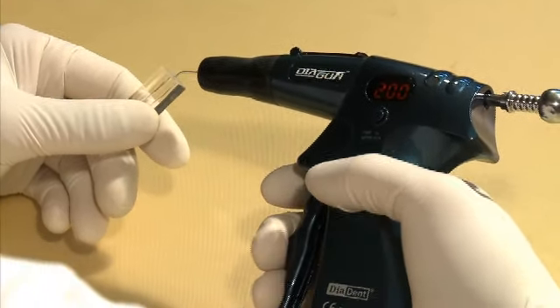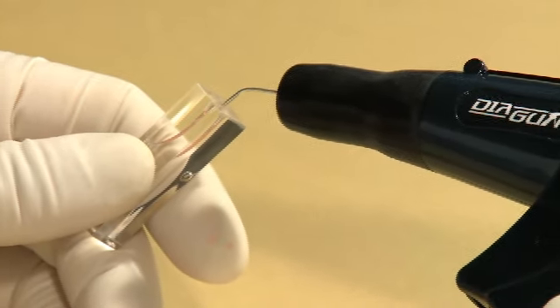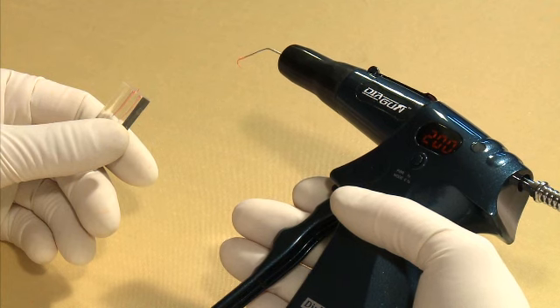Once the selected temperature is reached, insert the gun tip into the root canal and begin squeezing the trigger to fill the canal with melted Gutta Percha obturator.